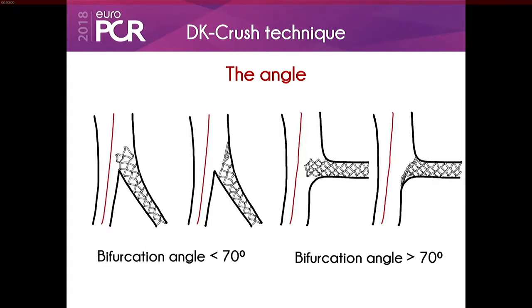So secure that OM. I would put a stent from the ostium of the circ to the OM, get rid of that dissection, and then it would be easy to go down with the wire down the circ, and at that point you have the choice of T or culotte or TAP.